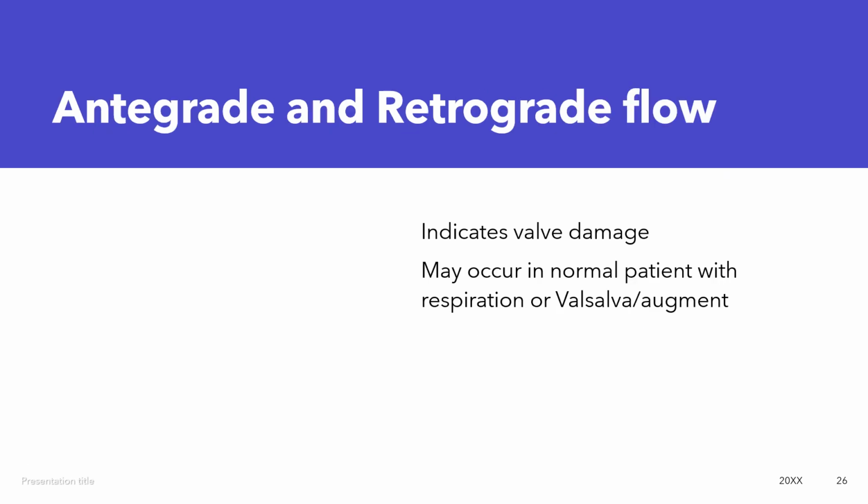Now, when you have those, it's going to be hard to evaluate for augmentation and Valsalva. Valsalva you should be able to accomplish, augmentation possibly, but phasicity would be very difficult. And so just be aware that that will limit your ability to assess that.